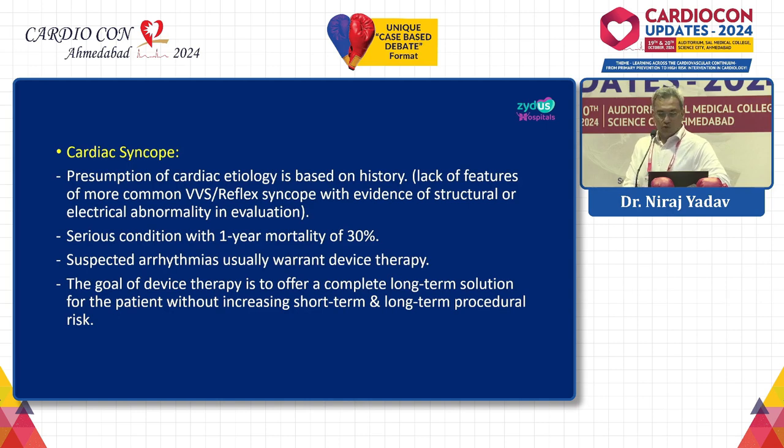Suspected arrhythmias usually warrant device therapy in cardiac syncope, and the goal of device therapy is to offer a complete long-term solution for the patient without increasing short-term and long-term procedural risk. In long-term procedural risk, I also include any upgrade that is required in future because of the wrong decision making at the first presentation.